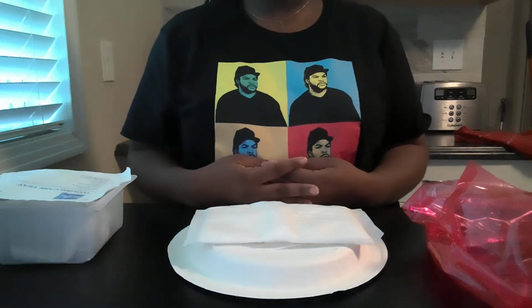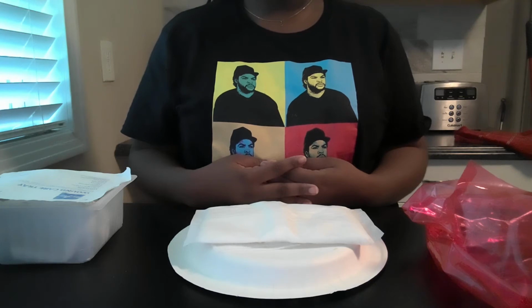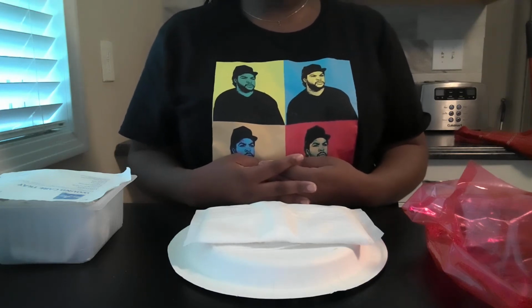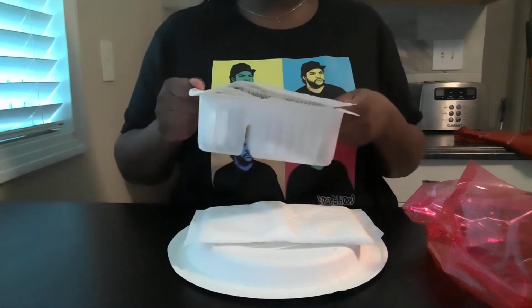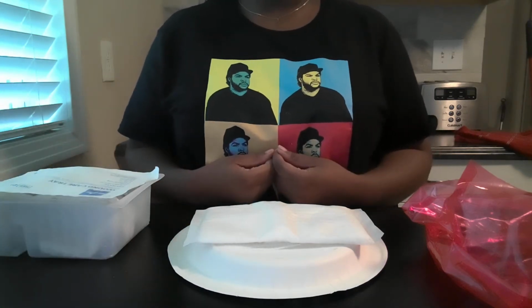Hello, my name is Nia, and today I'm going to be performing a proper wound care change, dressing change. One of the first steps I want to do is verify the provider's orders. Once I've done that, I'm going to grab a fresh wound care tray. Now that I've grabbed that, I'm going to head to the patient's room.